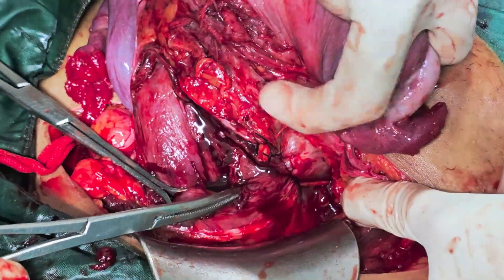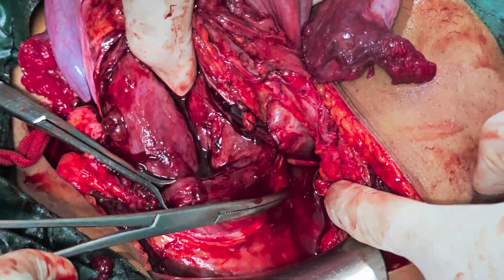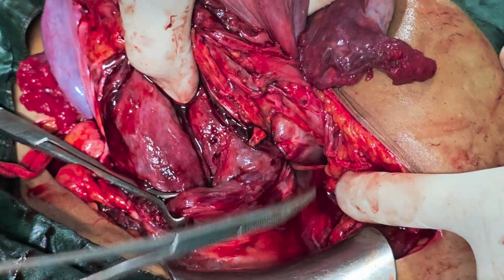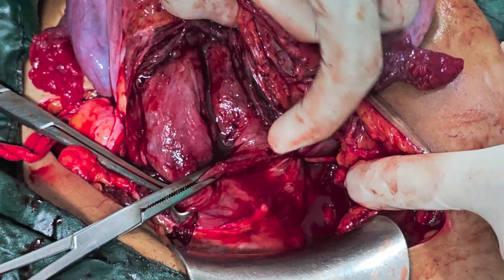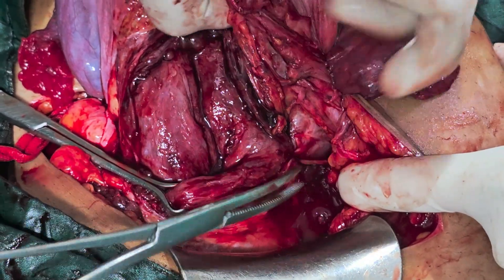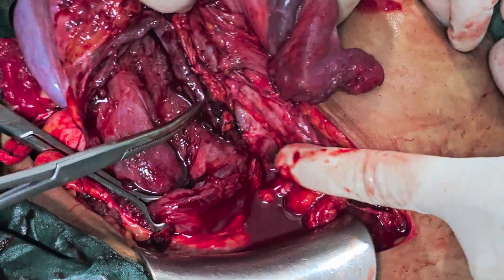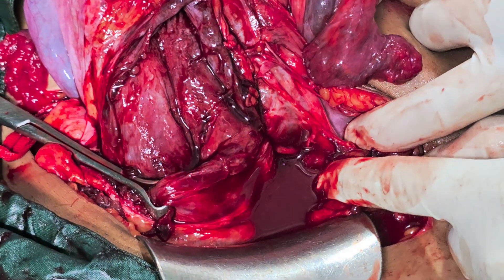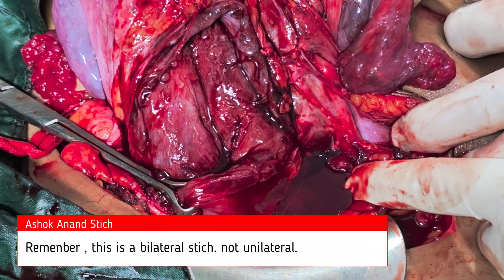Now, can you see this? This has caused an en-bloc closure. En-bloc means a complete block of the blood vessels that are coming to the lower segment. To repeat: 2cm below the cut edge laterally — first bite, come out posteriorly. Then 2cm above, insert the needle again and come out at the same point and put a stitch there. This is nothing but the Ashokanan stitch.